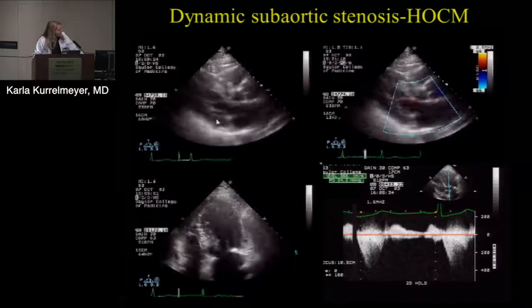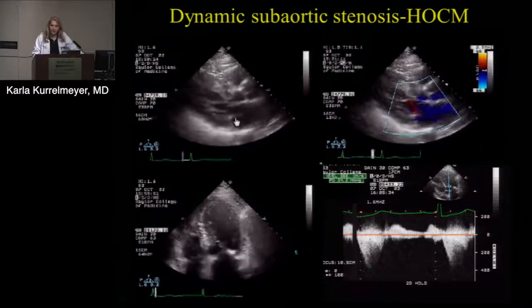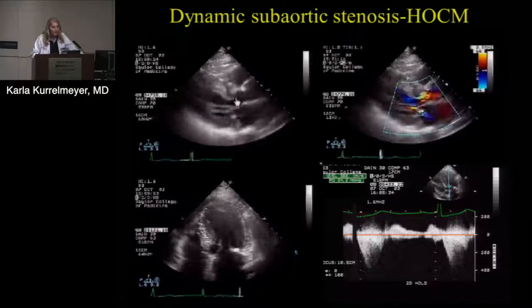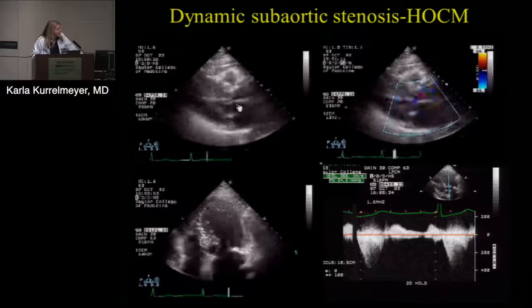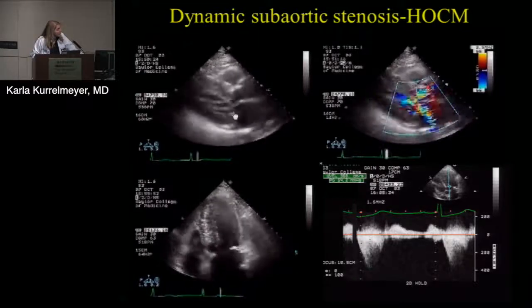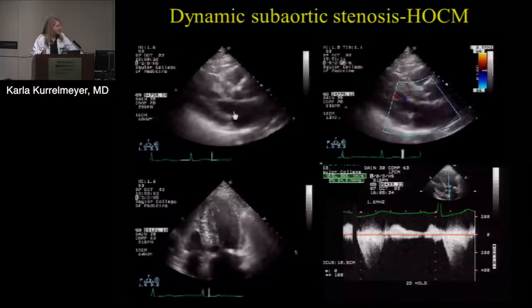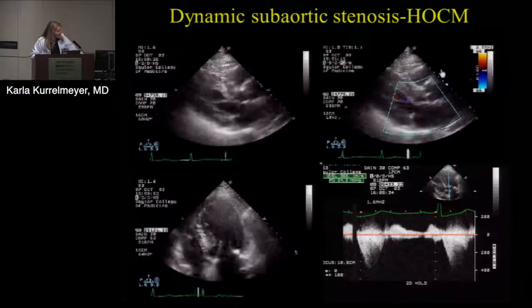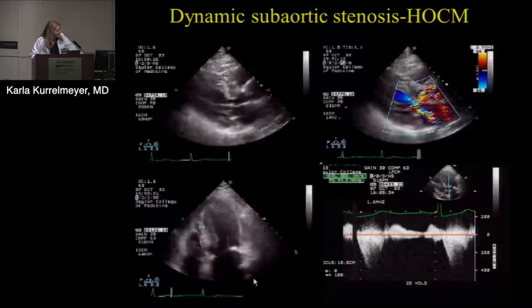Of course, you have this severe asymmetric hypertrophy and a big chunk, especially at the basal anterior septum, of muscle that's sticking right in that left ventricular outflow tract. The left ventricular outflow tract usually starts off on the smallish side in the first place. And then in mid-systole, when this contracts, you also have Venturi effects and a bunch of other theories of why that anterior mitral leaflet gets sucked in there and causes that typical systolic anterior motion of the mitral valve. When that happens, you have the mitral regurgitation, the flow acceleration, right where that big chunk of muscle is. Again, another good picture of SAM.